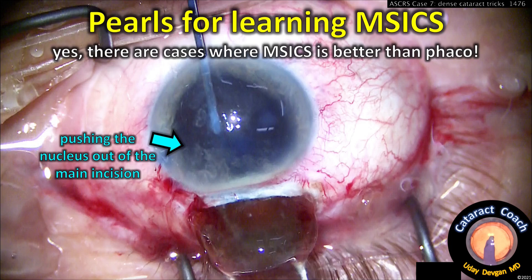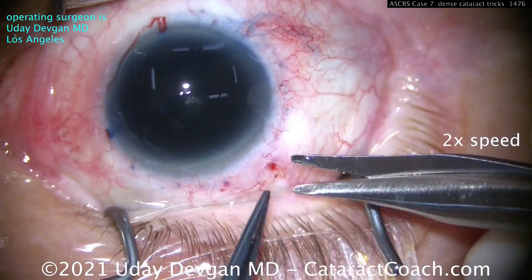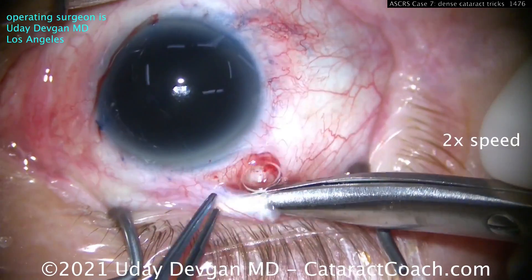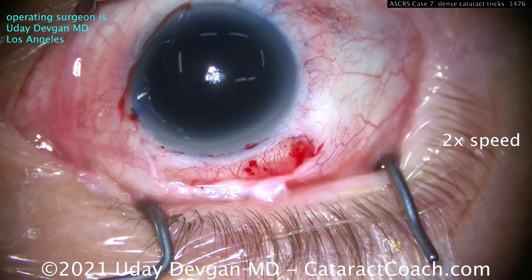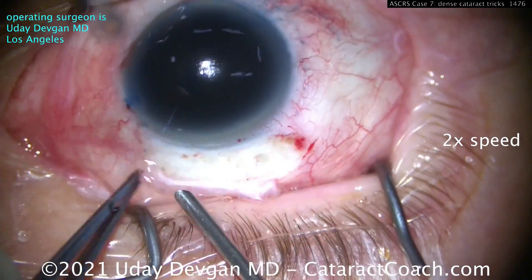Now let's talk about MSICS. You've got to learn how to do this — there are cases where it's better than phaco. Step one is making a good peritomy. We're starting here superiorly; get a good peritomy almost as wide as the cornea, and do some cautery to get hemostasis.